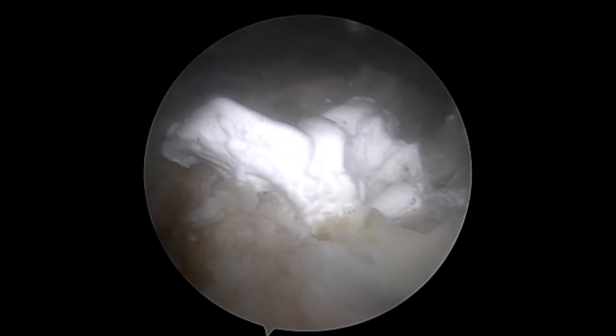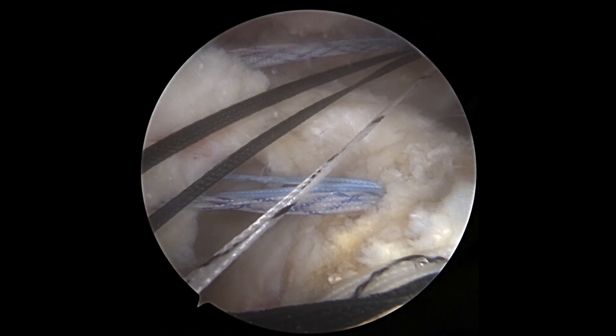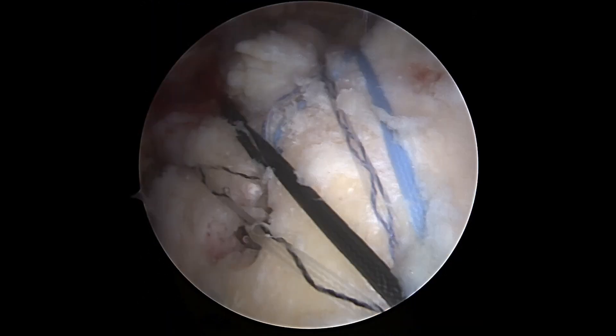Allow the graft to cure for 10 minutes, and then perform your typical preferred rotator cuff repair. In this case, I did a double row rotator cuff repair with four anchors and had no issues with fixation.